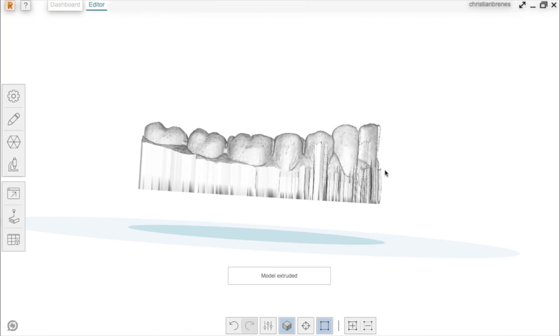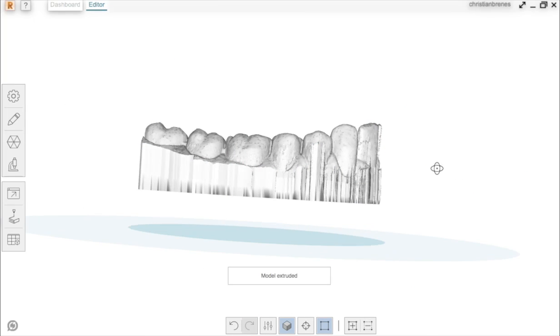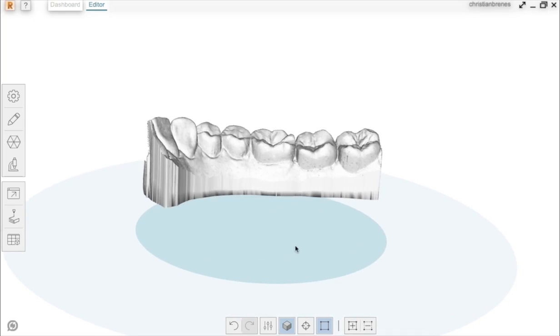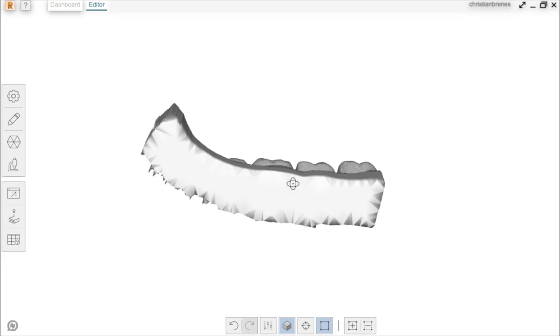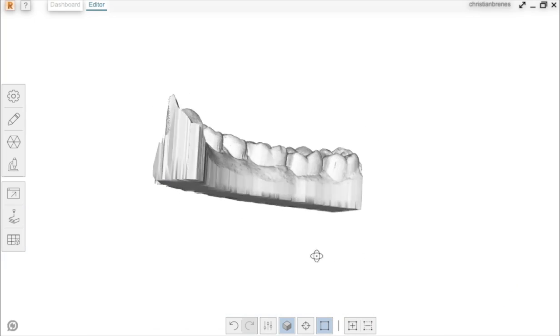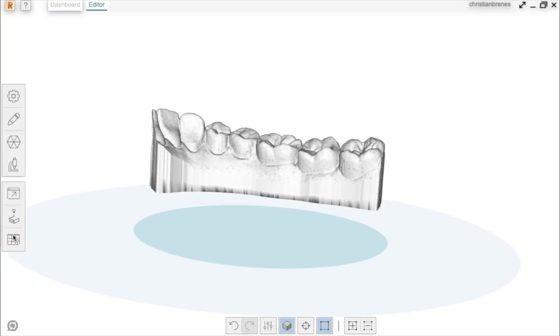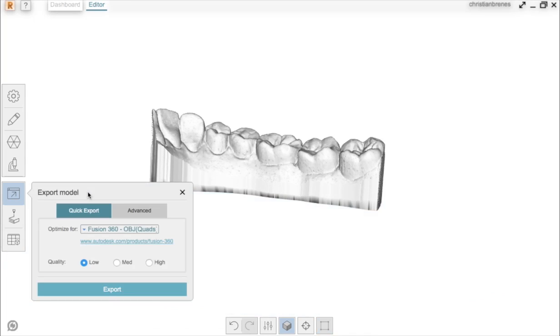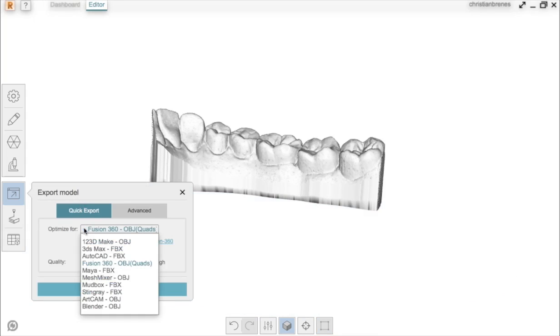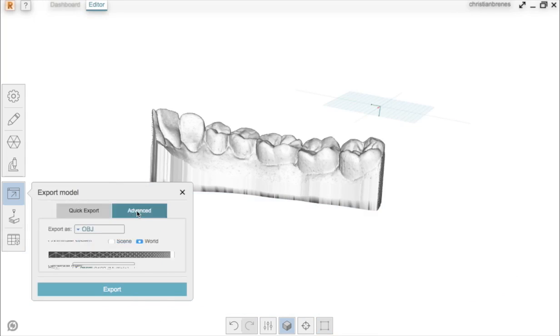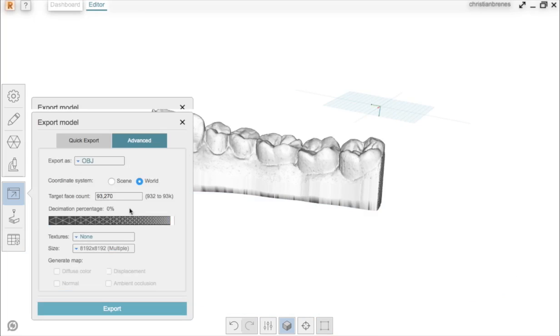After that, just click on Extrude, and that's it. You have a closed model with a base. To export the model, you go to the following icon, and you can choose between quick exporting an OBJ file or an STL file in the Advanced section.